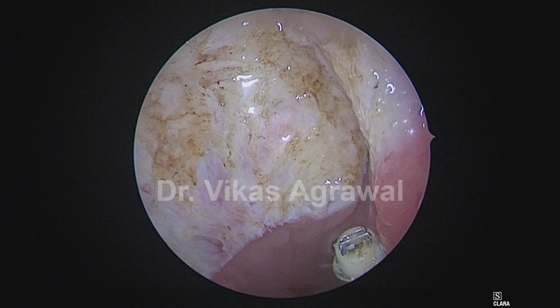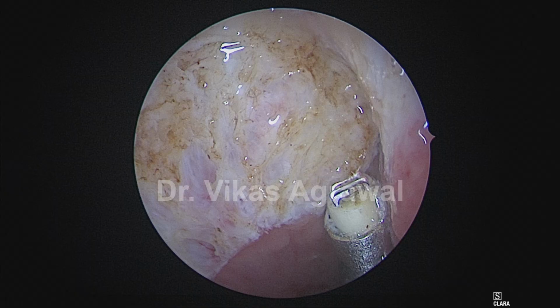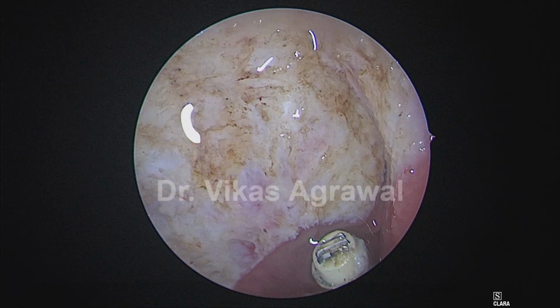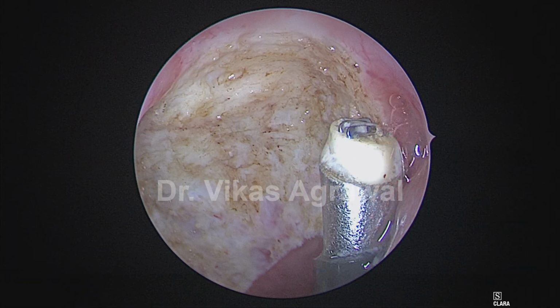All right, so that's the end of our surgery. Whatever little amount of tissue was there, these are the boundaries of the adenoids.